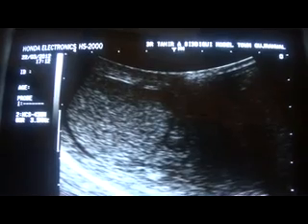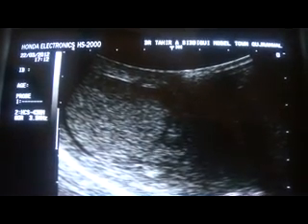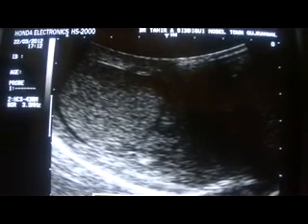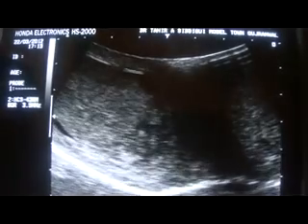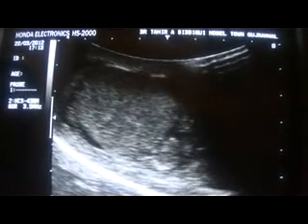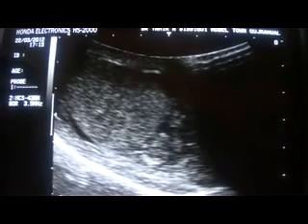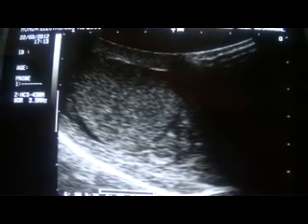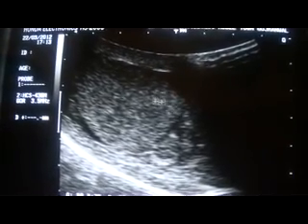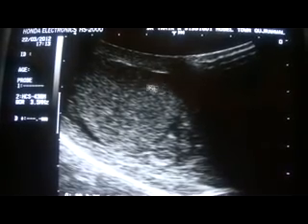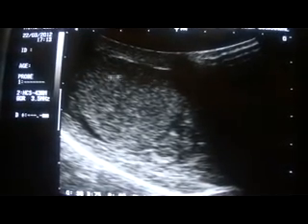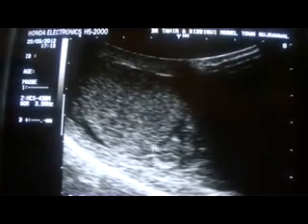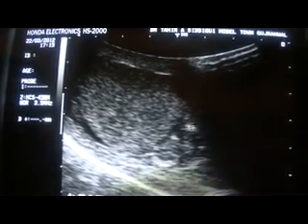This is the transverse section of the right testis with the mediastinum testis seen as normal. The encircled area here is the epididymis, and the second encircled area is the right testis. There is a small amount of fluid posterior to the right testis. The epididymis and testis appear normal.